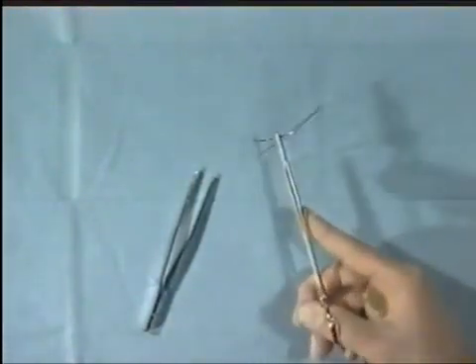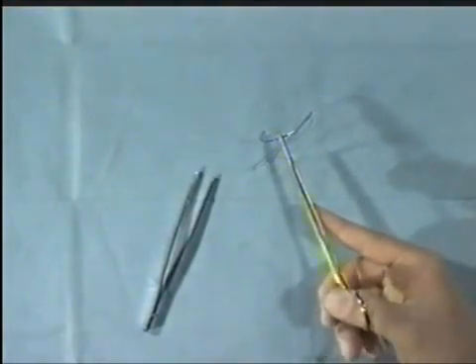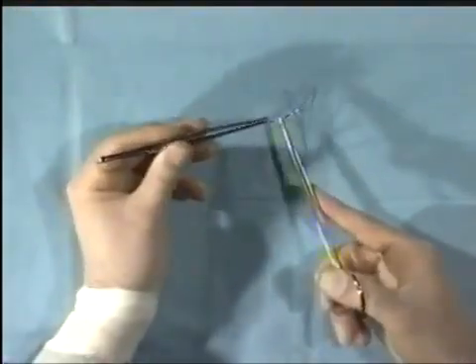When picking up needles, use the needle holder. If you wish to alter the position of the needle in the needle holder, don't use your fingers — use the forceps to hold the needle and then reposition it.